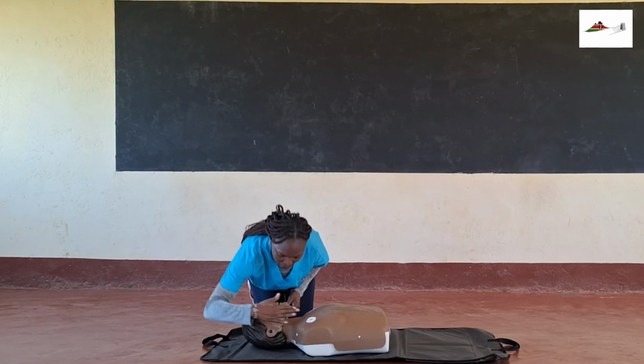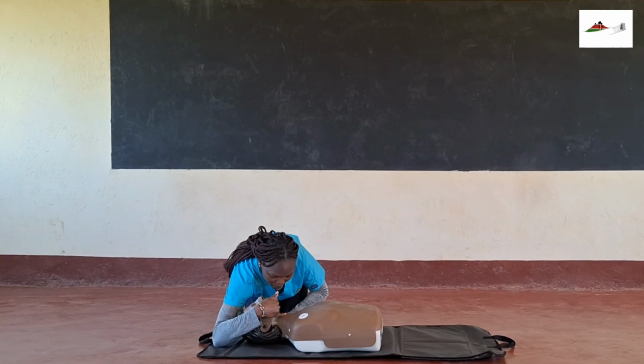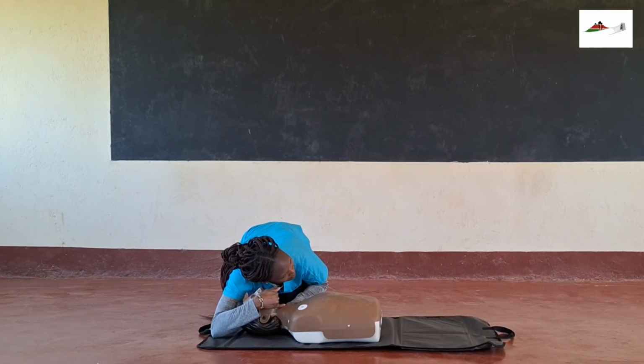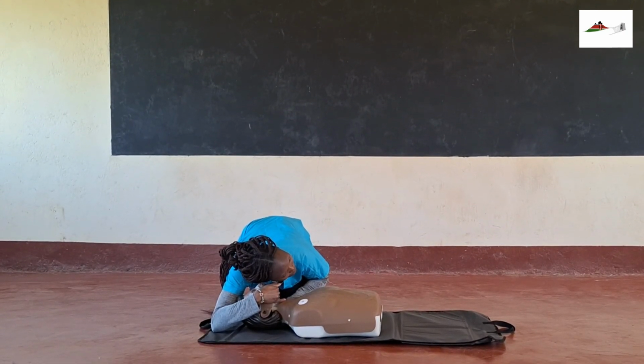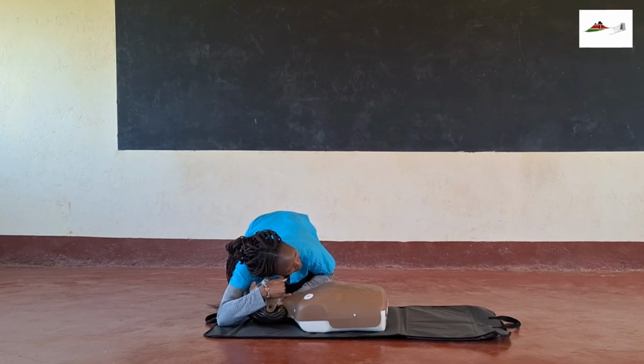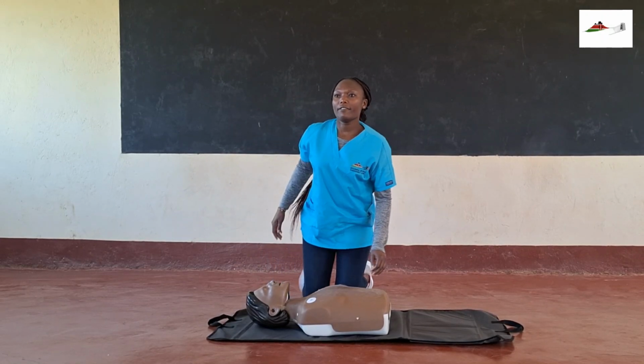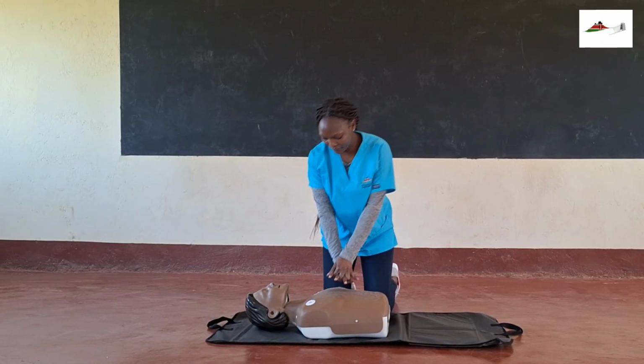John. 1, 2, 3, 4, 5, 6, 7, 8, 9, 10. I need some help, please. I have a patient in cardiac arrest.